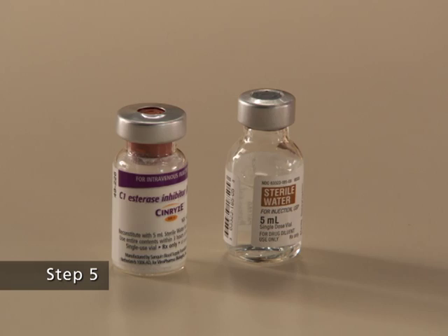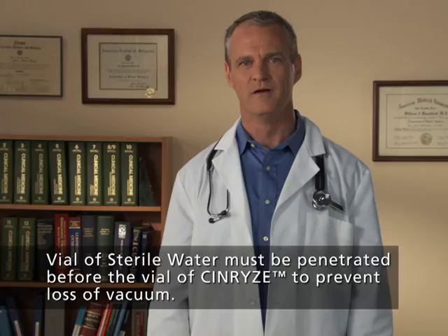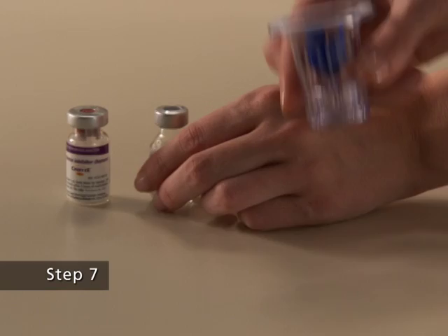Step 5. Step 6. The vial of sterile water must be penetrated before the vial of Synrise to prevent loss of vacuum. Remove the protective covering from the top of the Mix 2 vial transfer device package. Do not remove the device from the package. Step 7. With the vial of sterile water on a flat surface, place the blue end of the Mix 2 vial transfer device over it.